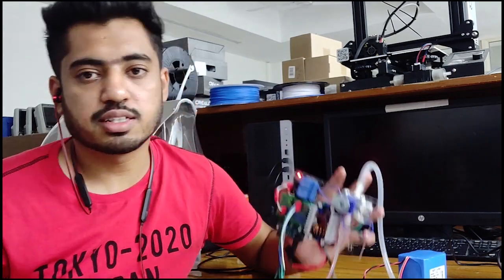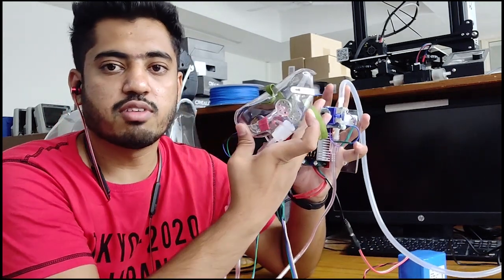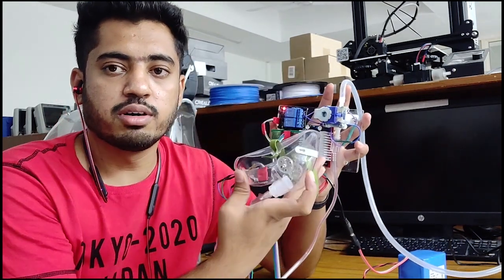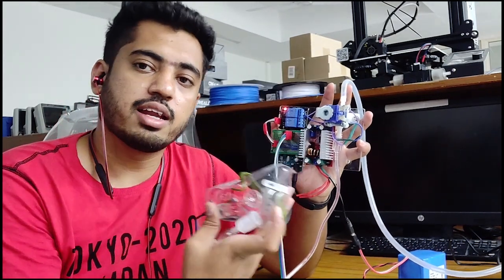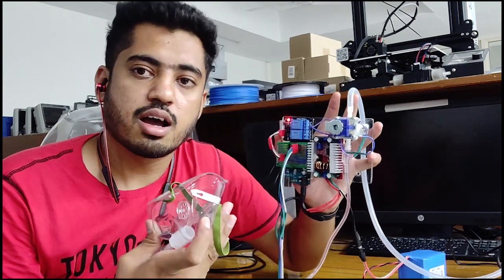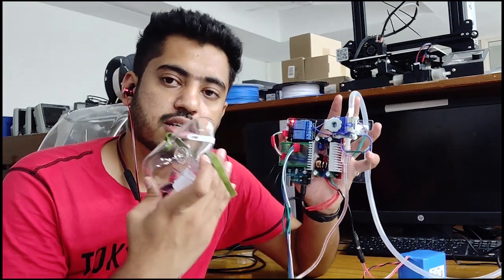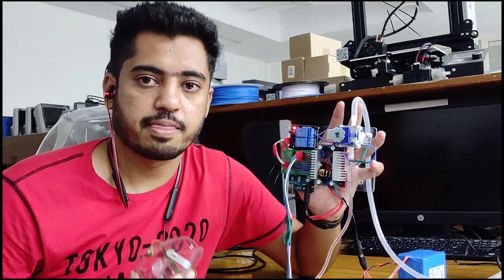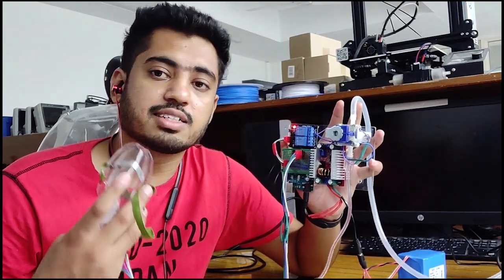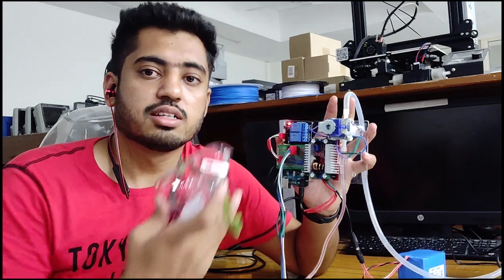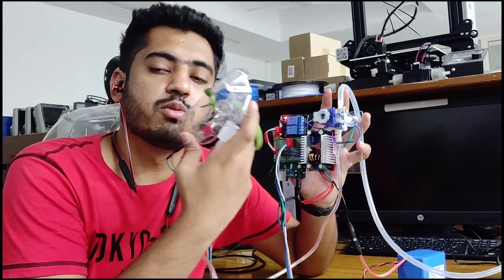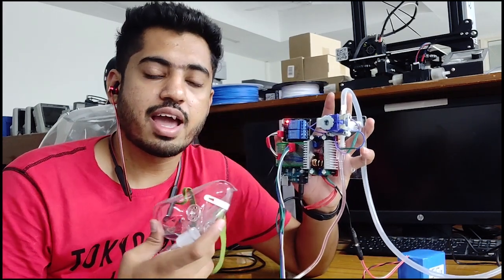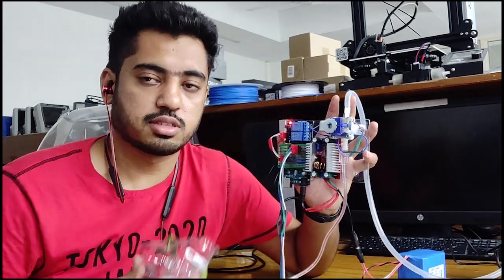During the inhalation process, this solenoid valve will open and it allows a continuous flow of oxygen supply. And during the exhalation process, the solenoid valve will close and it stops the supply.